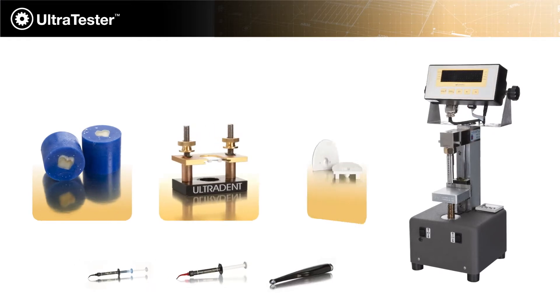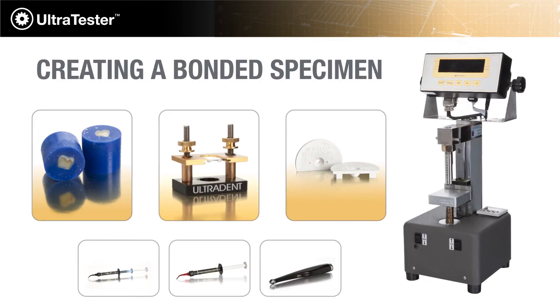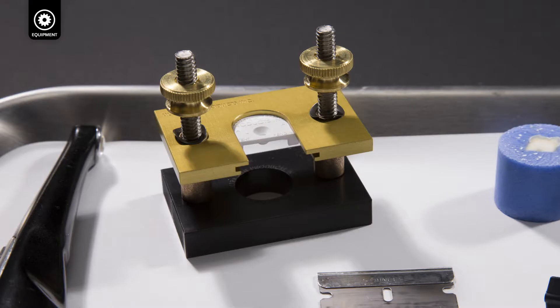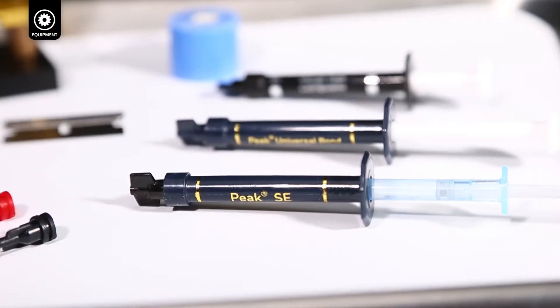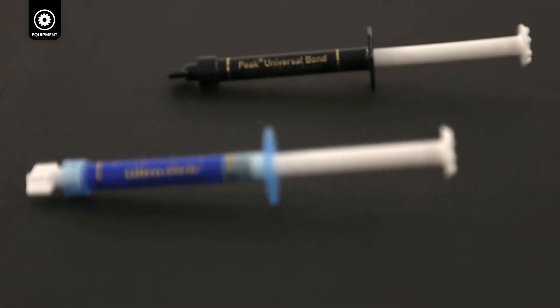In this video, you'll learn how to create a bonded specimen ready for bond strength testing. The steps you'll see in this video conform to the latest ISO standards for bond strength testing. We'll be demonstrating a self-etch technique using the Peak Universal adhesive system. If you prefer a total etch technique or a different adhesive system, follow the manufacturer's instructions.